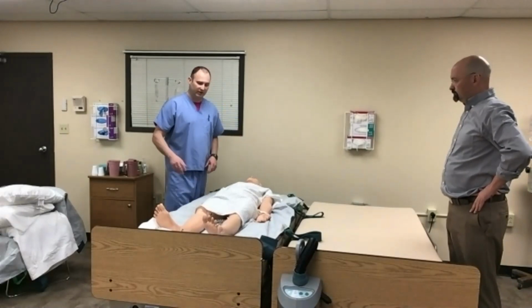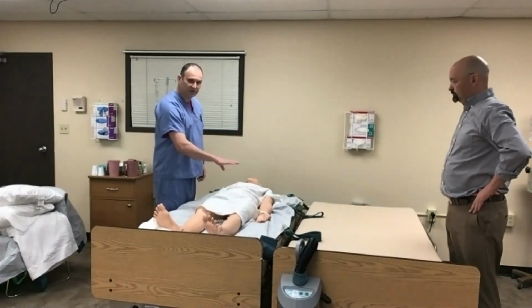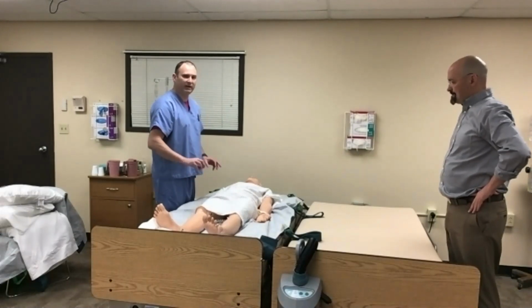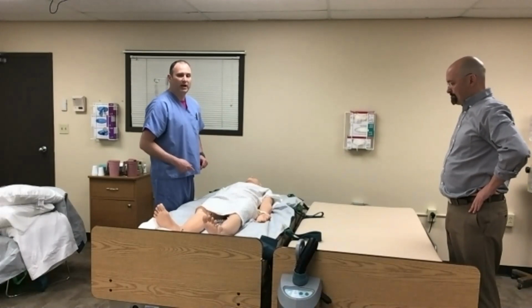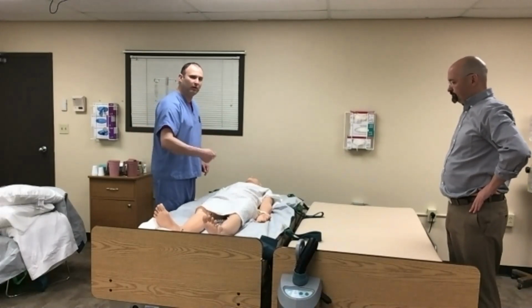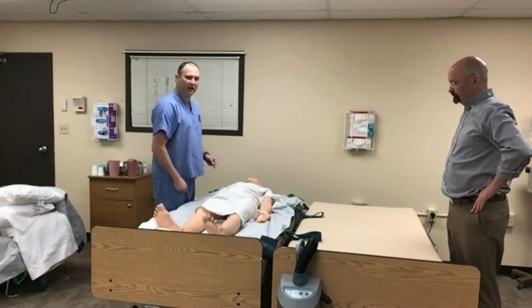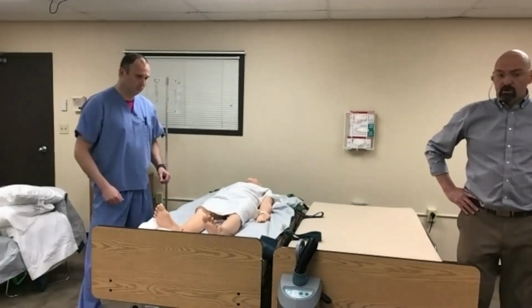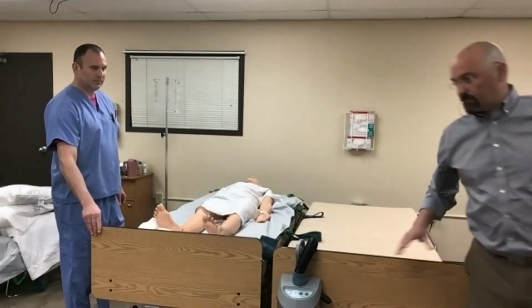You also want to make sure that you check whether it's a TLC or whatever peripheral lines you have. Check with the nursing staff as to what can and cannot be disconnected, and make sure you position those at the head or the foot of the bed so that they don't get wrapped up in the patient as you're proning them. Excellent. So what we're going to do first is by using an air transfer device.